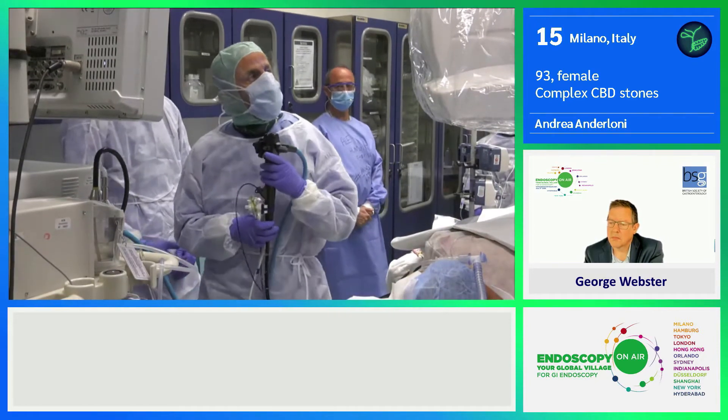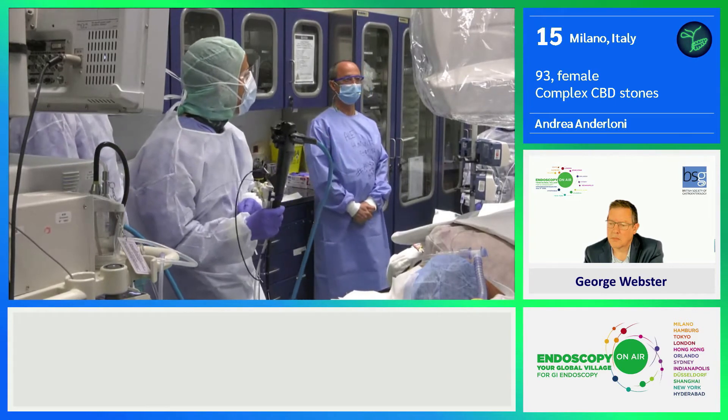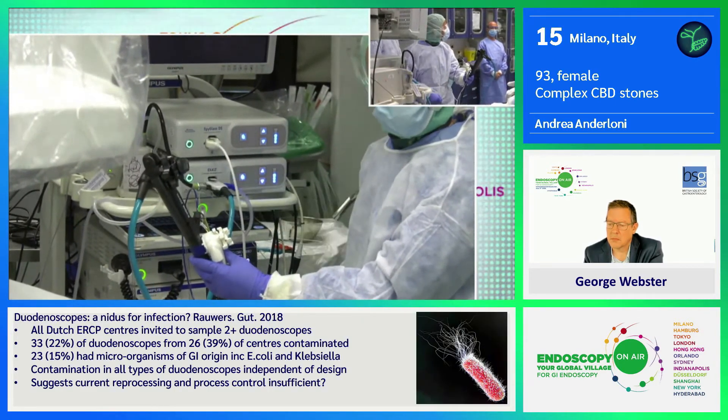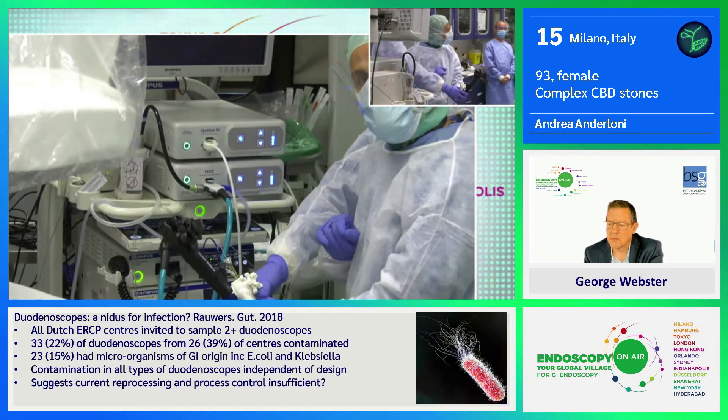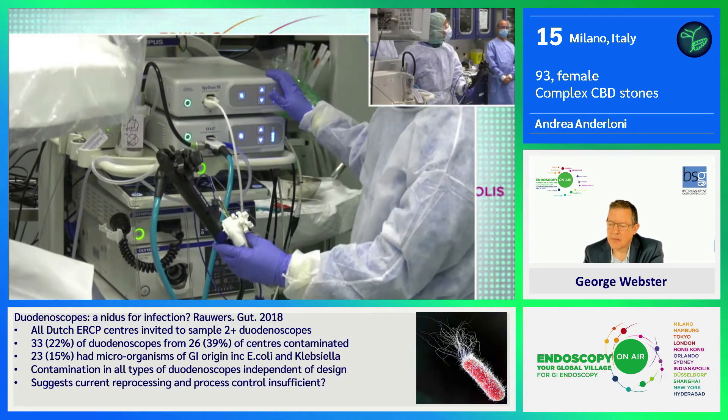Today we are going to treat it with lithotripsy using some new scopes. I'm working today with the Boston Scientific single-use scope. You can connect it with the classical CO2 system and bring it wherever you want — it's ready to use.